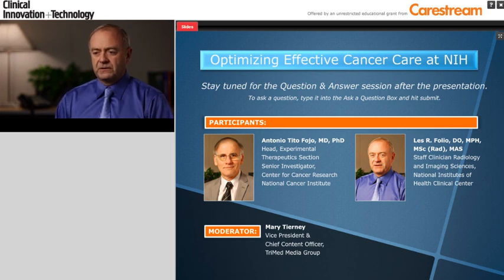The first study that I was interested in doing was with metastatic melanoma, because the distribution of the melanoma skin lesions was similar to blast fragments, where they were chaotic and not really based on organ systems. So the first study was published in Academic Radiology last year, describing the success of finding lesions. And we were between 70 and 80% consistent in finding prior lesions. The registration was right on.